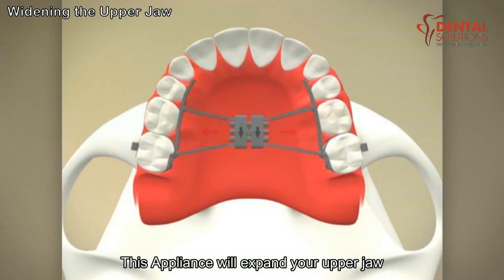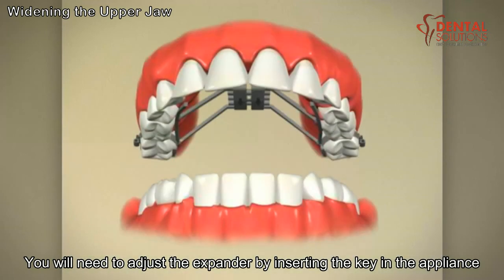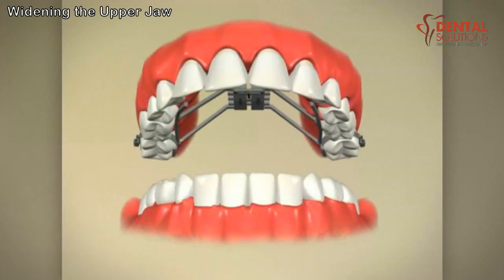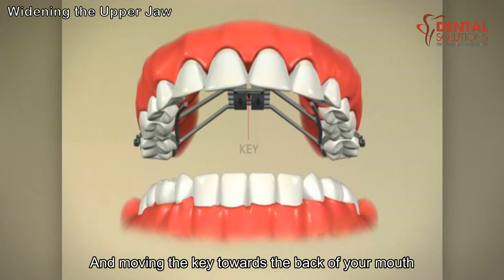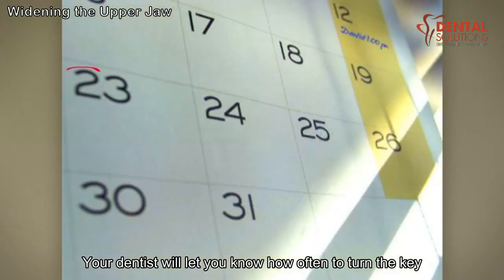This appliance will expand your upper jaw by applying a constant pressure. You will need to adjust the expander by inserting the key in the appliance and moving the key towards the back of your mouth. This is one turn of the key. Make this adjustment each night. Your dentist will let you know how often to turn the key.